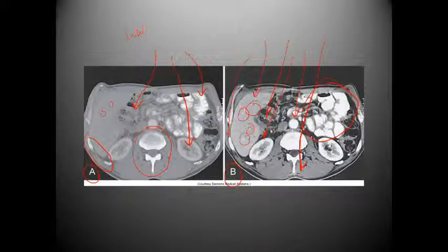Maybe not to the same degree that we do with the bone windows. So, as you can see, this would be a normal to medium window width. And so I don't expect you to know what these numbers are for these window widths because each manufacturer is going to be very different.